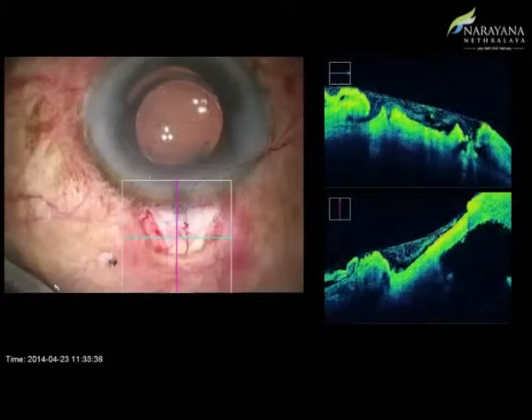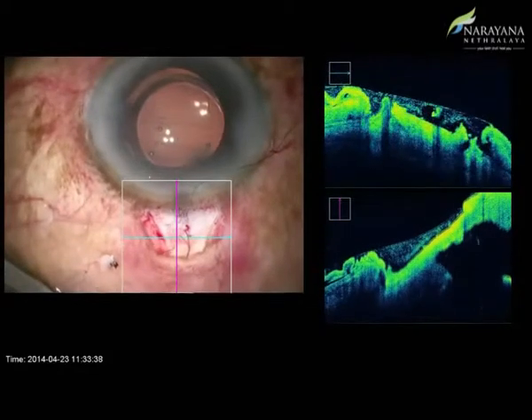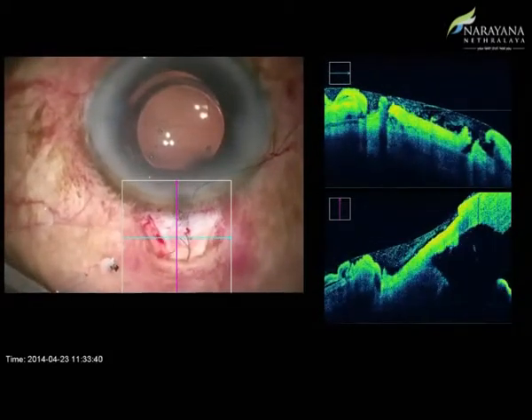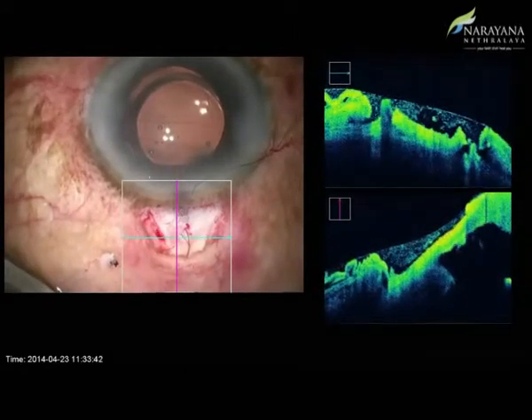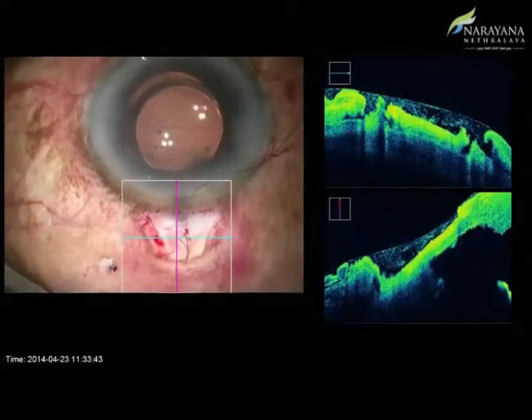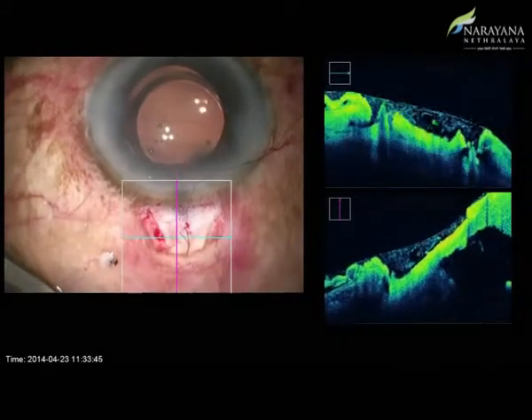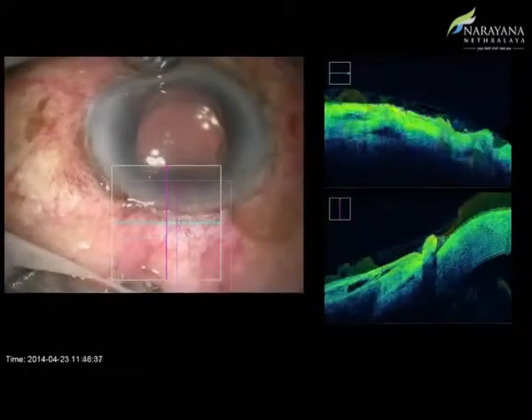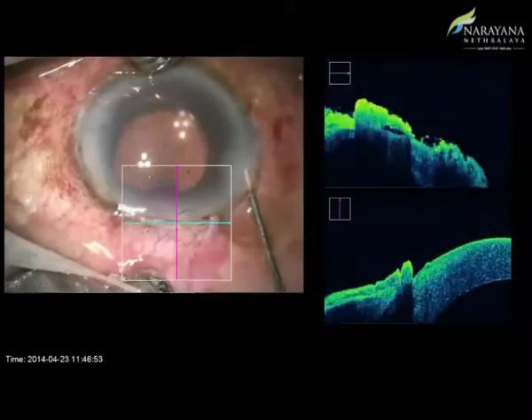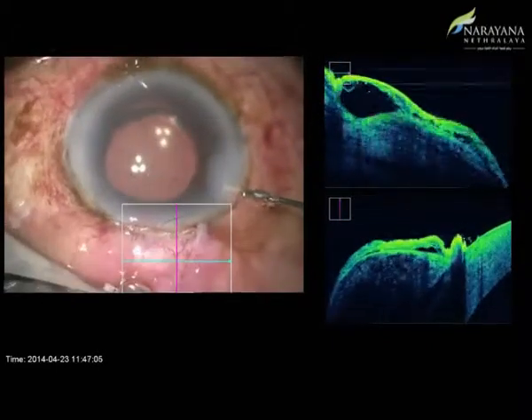Another potential application of this imaging tool could be during deep scleral flap dissection in non-penetrating glaucoma surgeries, where the precise depth of the dissection is mandatory to prevent it from becoming a full thickness procedure. This aids in obtaining precise trabeculo-descemetic windows. And at the end of the surgery, we can see a diffuse bleb elevating after injection of saline through the side port.